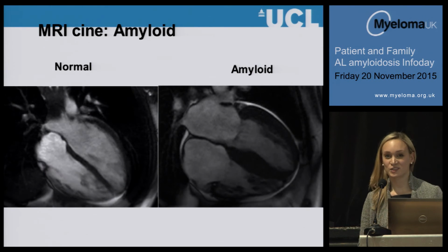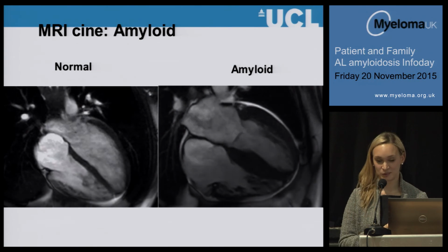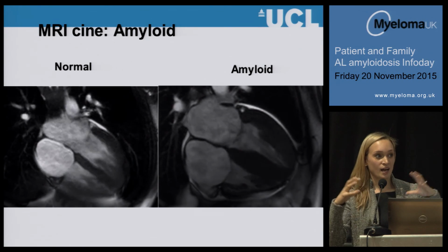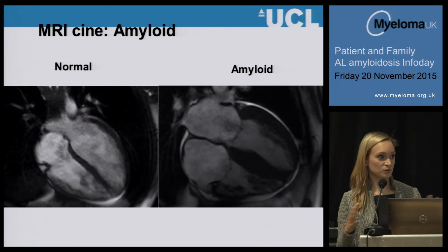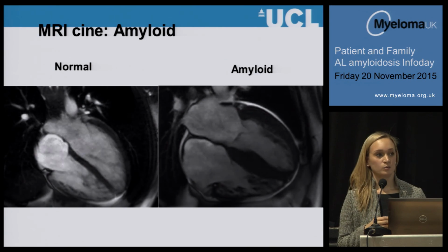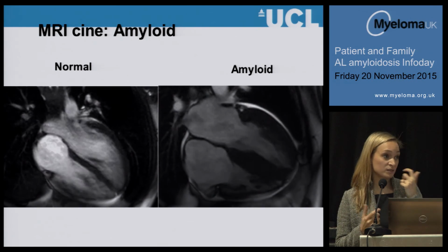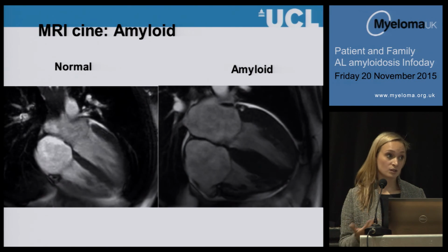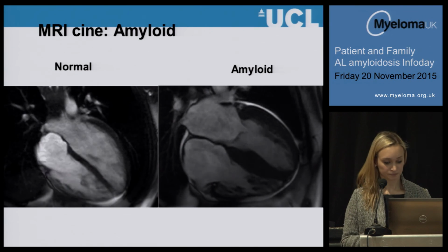So I hope you enjoyed the video, even though the audio quality was poor and there was a bit of delay between the audio and the images. But I thought it was important to show you what the scanner looks like. Even if you are claustrophobic, please do not say no straight away. There are lots of things that we can try, and we can make the scan shorter, we can change the position, and one of the best things about this scanner is that it's completely radiation free, it doesn't cause any harm, so all of you can basically have the scan.